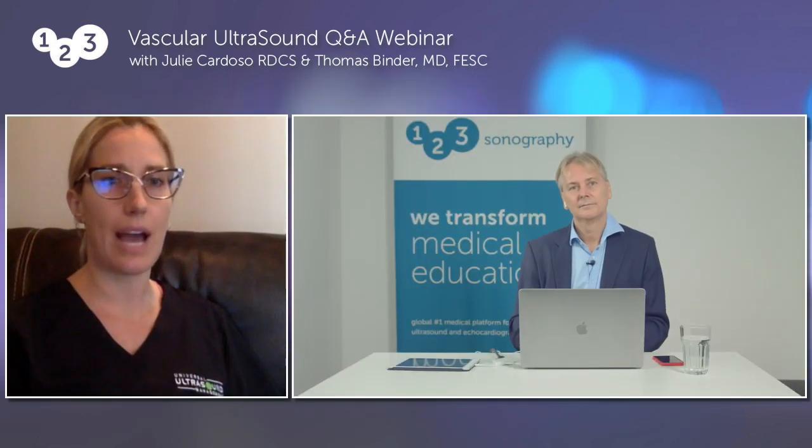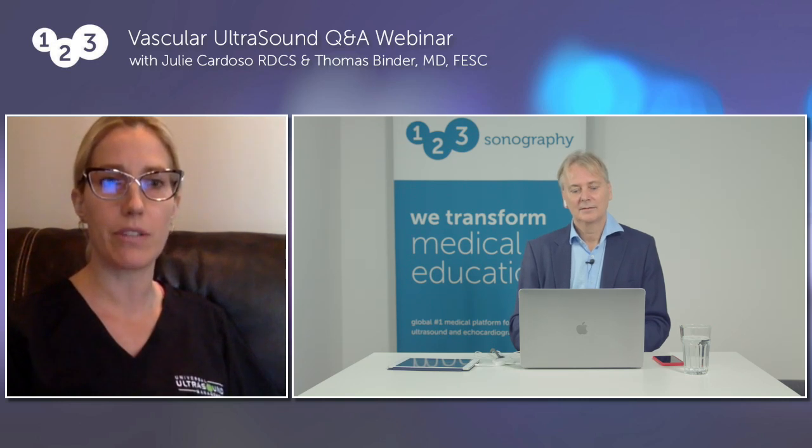to use to get access into these vessels. And also when they use vascular access, they use ultrasound to get access. So it's pretty standard all the time. Yeah, we use it. It's the appropriate way to answer that.